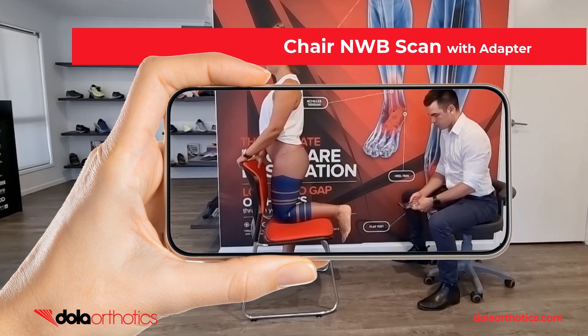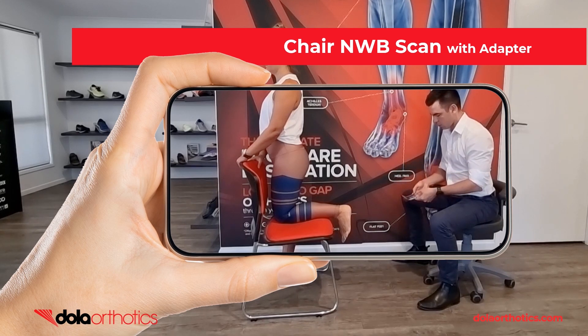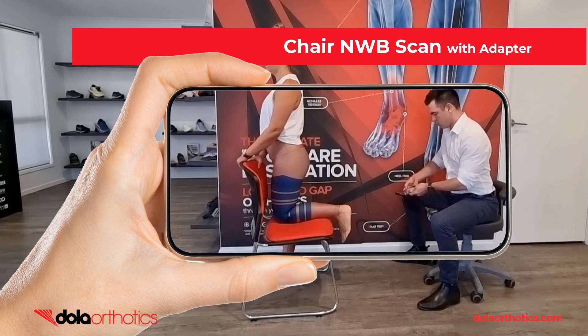Here is a demonstration of the iPhone with the Dollar iScan adapter being used to capture a non-weight bearing foot using a chair to aid in patient positioning. The adapter provides easier visualization of the screen during the scanning process in a challenging clinical environment.